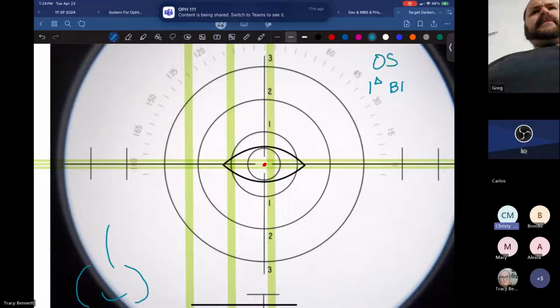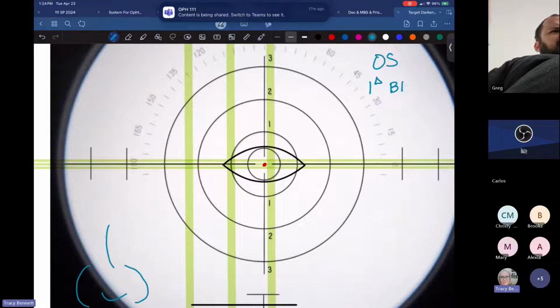On this, you don't have to worry about a minus lens or a positive lens. It's just the direction straight up. That's what I love about the lensometer. It is what it is. I know that's a cliche, but if you just think of that being the base direction, I don't care what the power of the lens is, you'll just put it where it needs to go.